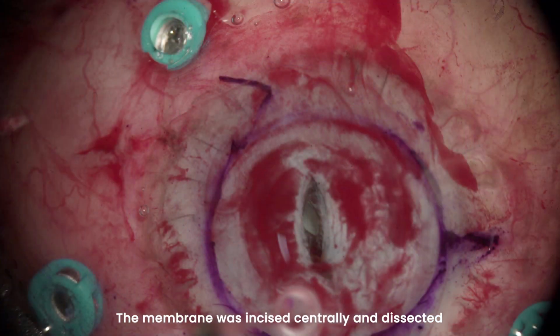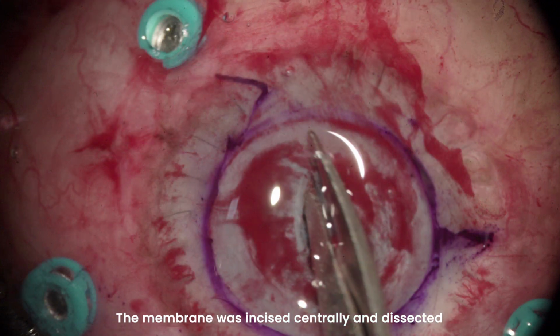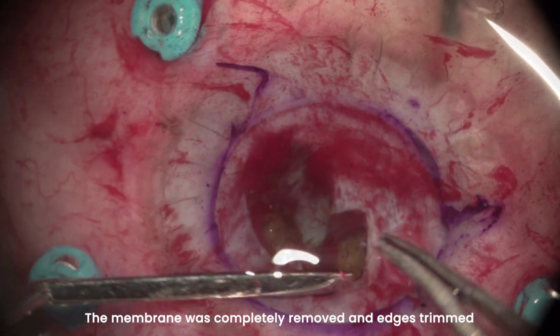The retrocorneal membrane was incised centrally and dissected. The iris was separated from the membrane during dissection. The membrane was completely removed and the edges were trimmed.